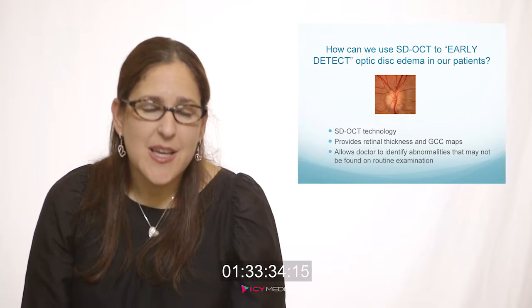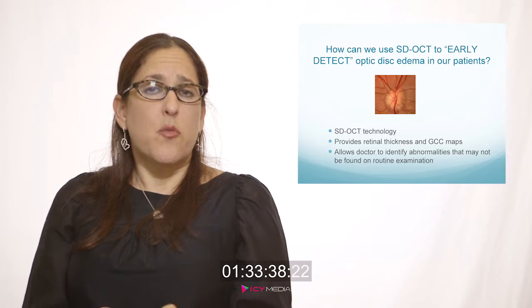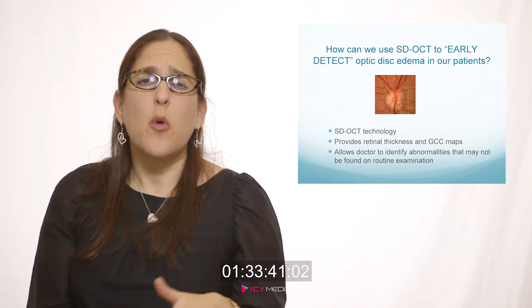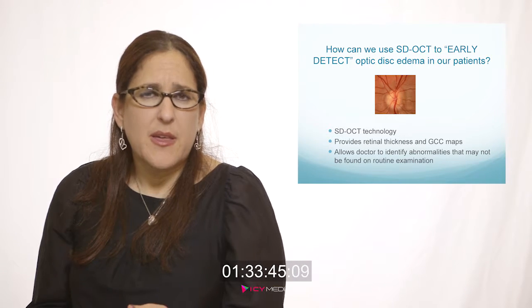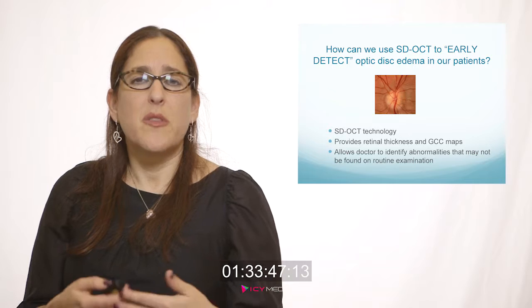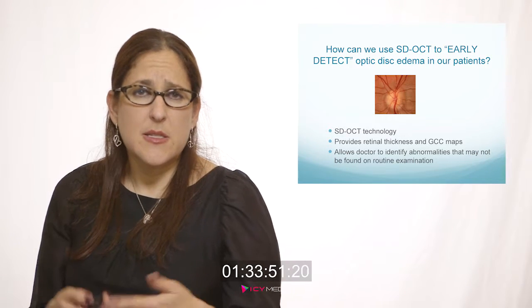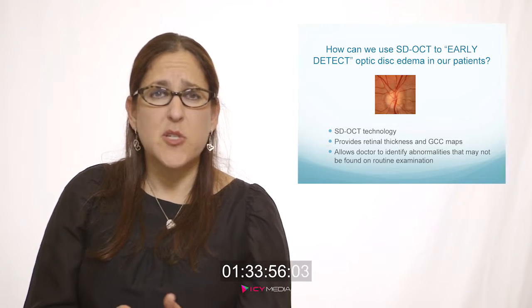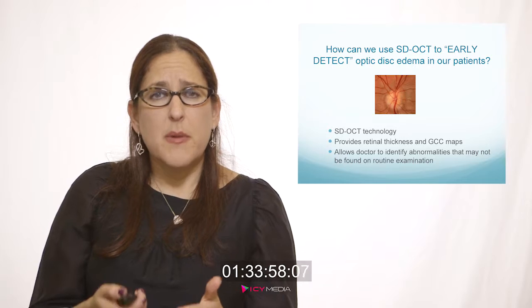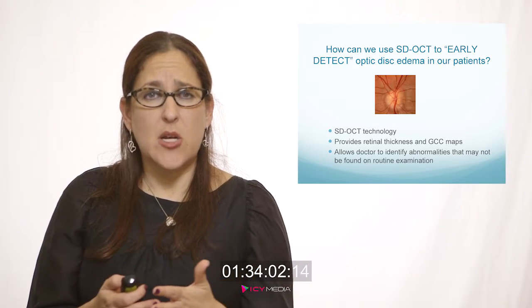So the question always is, how can I use my OCT to the best of its ability? I have it in my office. I know that I can use it for retinal disease. I think that when we're in school, we always think about OCT for retina and perhaps for glaucoma, but I don't think that most practitioners are familiar with how you can actually use OCT for other conditions. Diseases of the optic nerve, in particular, diseases where there's maculopathy from toxic effects, other things like that. But in this presentation, we're going to focus on optic disc edema and how you can use this technology.